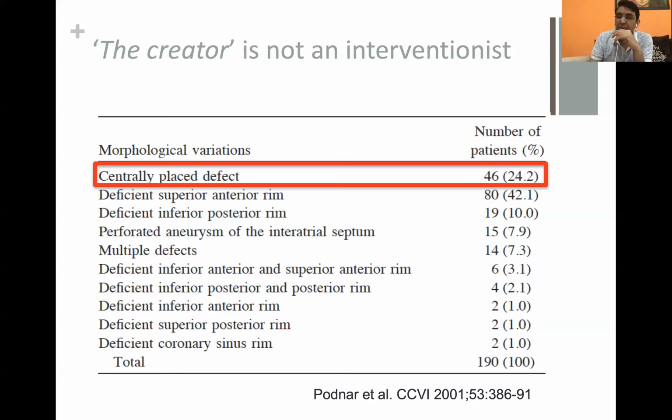Yeah. So actually, I did not want to take too much time on that. I thought that the next speakers will take that on. But this case particularly, I wanted to show there was no problem with the device size. There was a problem with the orientation in which we were coming from the left atrium.